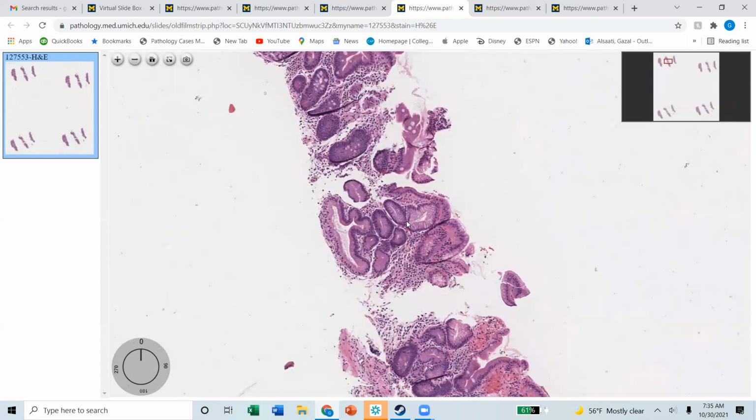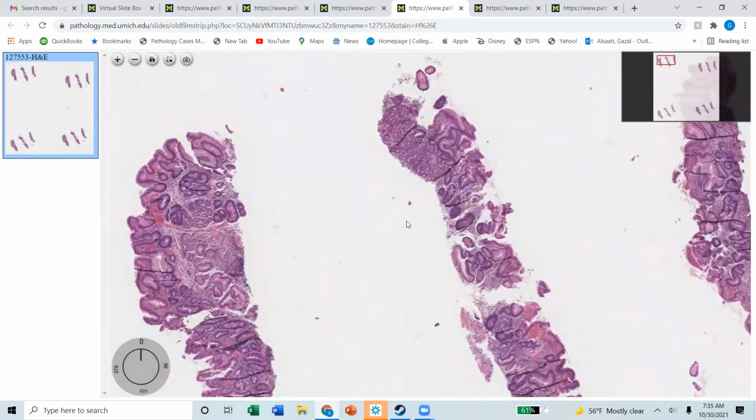However, with IM and Paneth cell metaplasia, in your head you have to have a checklist. Number 1, loss of oxyntic mucosa. Number 2, intestinal metaplasia. Number 3, Paneth cell metaplasia. Okay. Number 4, chronic inflammation. Number 5, loss of gastrin. Number 6, ECL cell hyperplasia shown by chromogranin or synaptophysin. Okay, you have a whole big picture of this in the body. Then you will call this chronic atrophic gastritis. Differential is H. pylori versus AMAG.